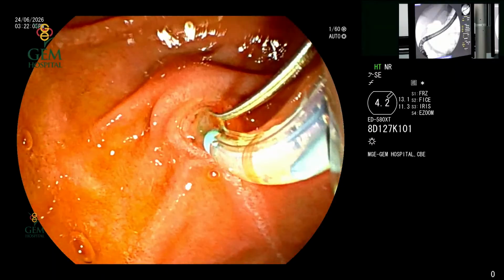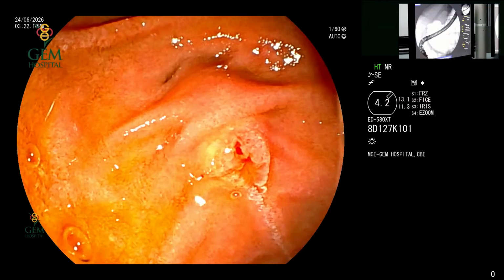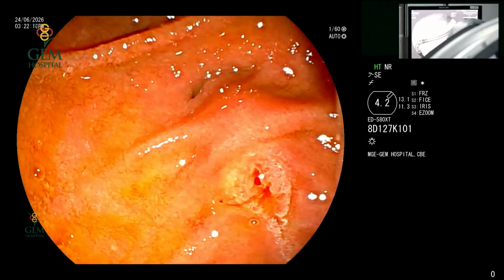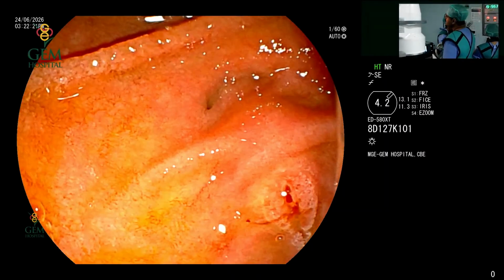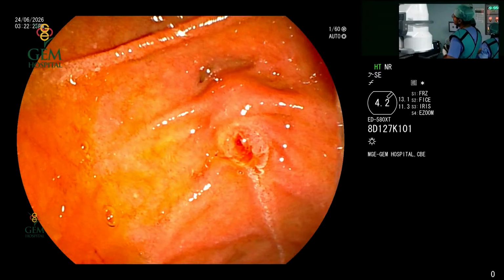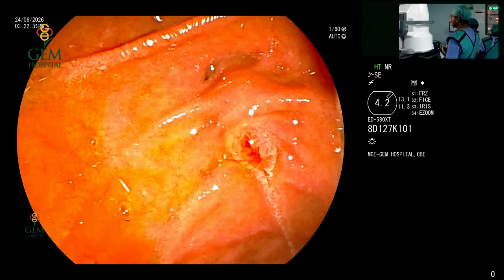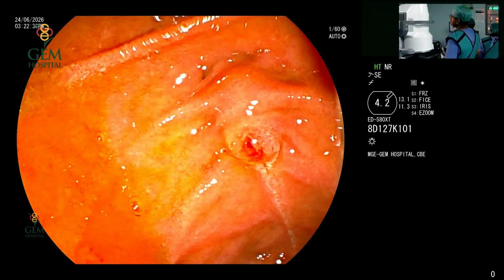Okay. I'm glad they didn't cannulate. I like cutting the sphincter more than meddling with it for more than 5 minutes. Our cutoff, at least in our unit, is 3 attempts. 5 minutes is where we stop and go for a pre-cut sphincterotomy. That is where we stop meddling with the sphincter. The more time you take for a cannulation, the more the chances of post-ERCP pancreatitis. So it is worthwhile to use a pre-cut sphincterotomy much earlier on.